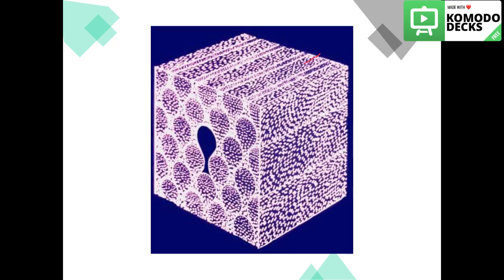walk horizontally to the long axis, while in the peripheries the crystals deviate. In the tail too, the crystals deviate. This deviation in the tail area and in the peripheries of the head is the cause of sharpening the boundaries of the pattern and makes it more visible to the eye.